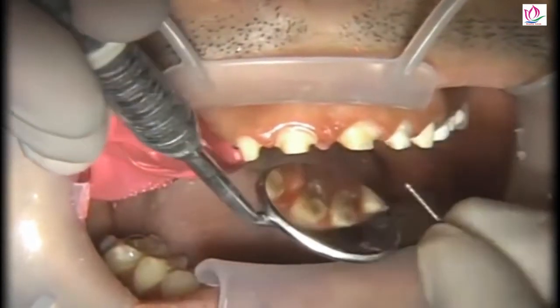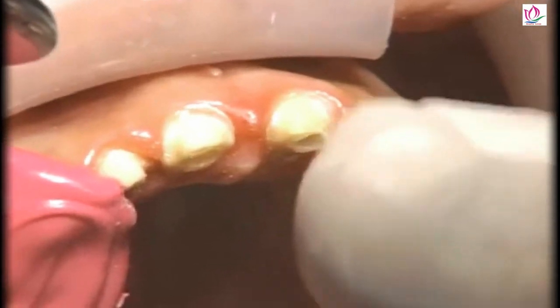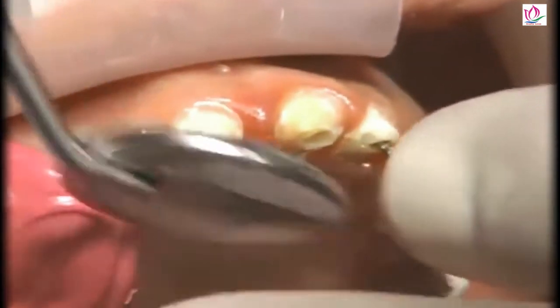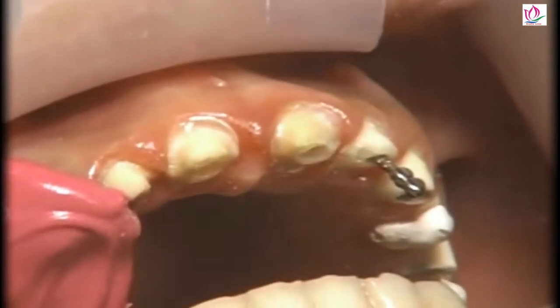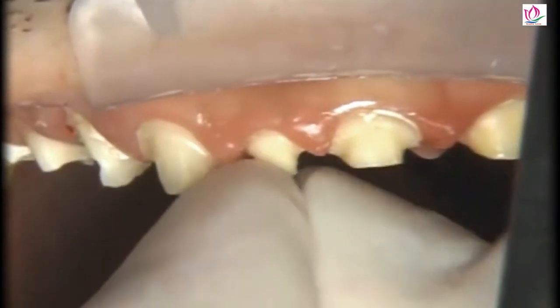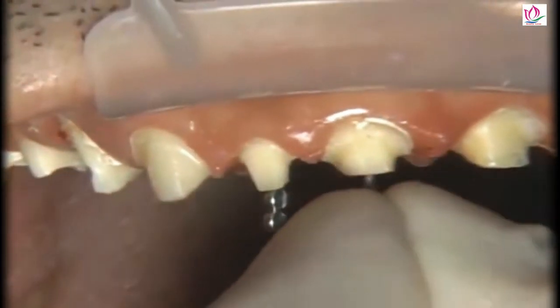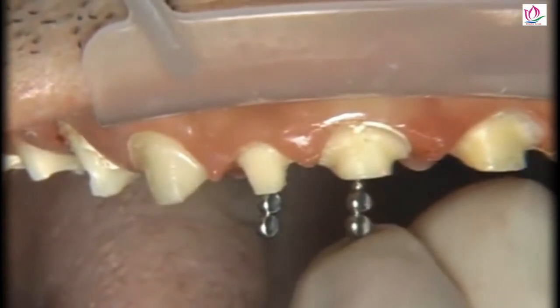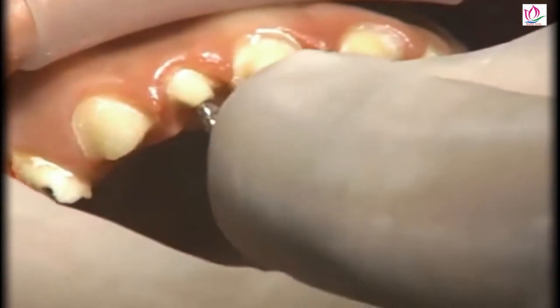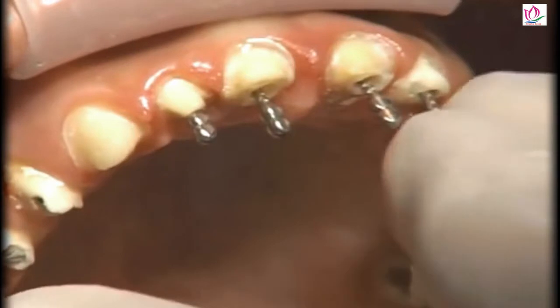These teeth were endodontically treated about a year ago as a result of his GERD condition, and we're going to take advantage of that by placing some titanium posts and composite buildups to get more mechanical retention to hold these crowns in place. When you see biotemps come off when they're splinted — four, five, or six teeth together — you know you're getting more retention than you will with single units, even though they're only on with temporary cement. So if biotemps are chronically coming off when splinted, we know we have a problem. We're going to put some post and cores in place, and we're going to gain some length at the incisal edge of the teeth, making our preps a little longer, because that's the best way to gain additional retention.